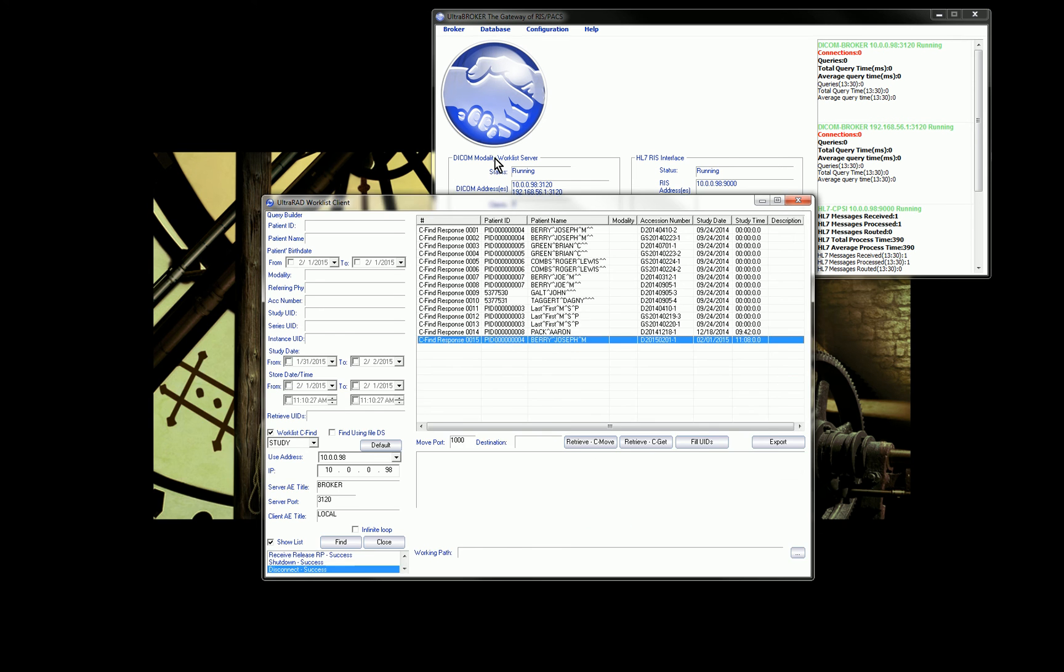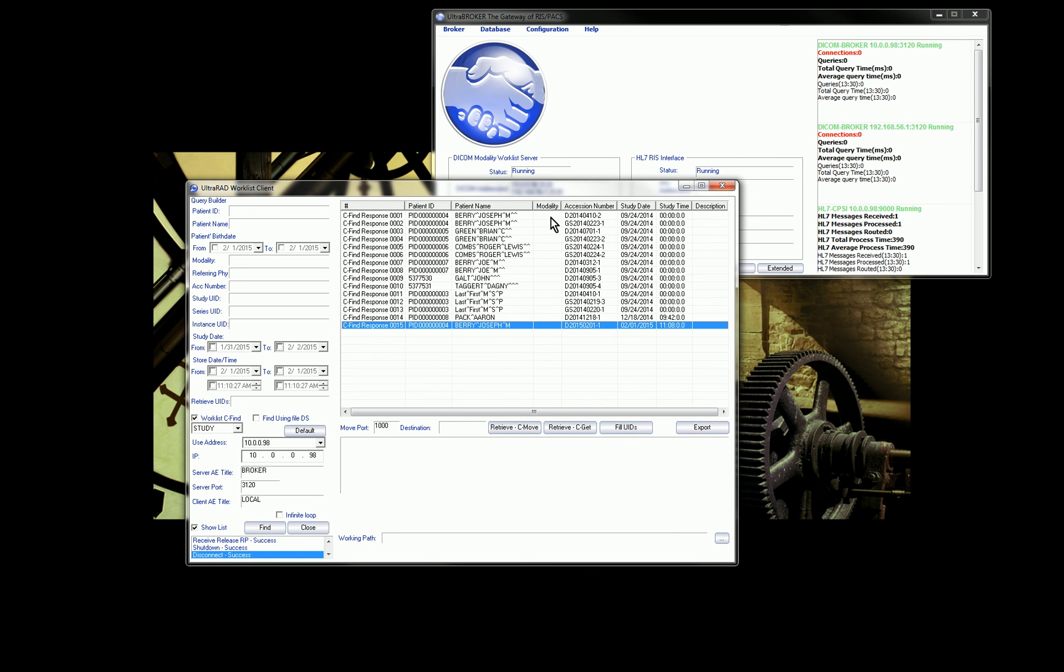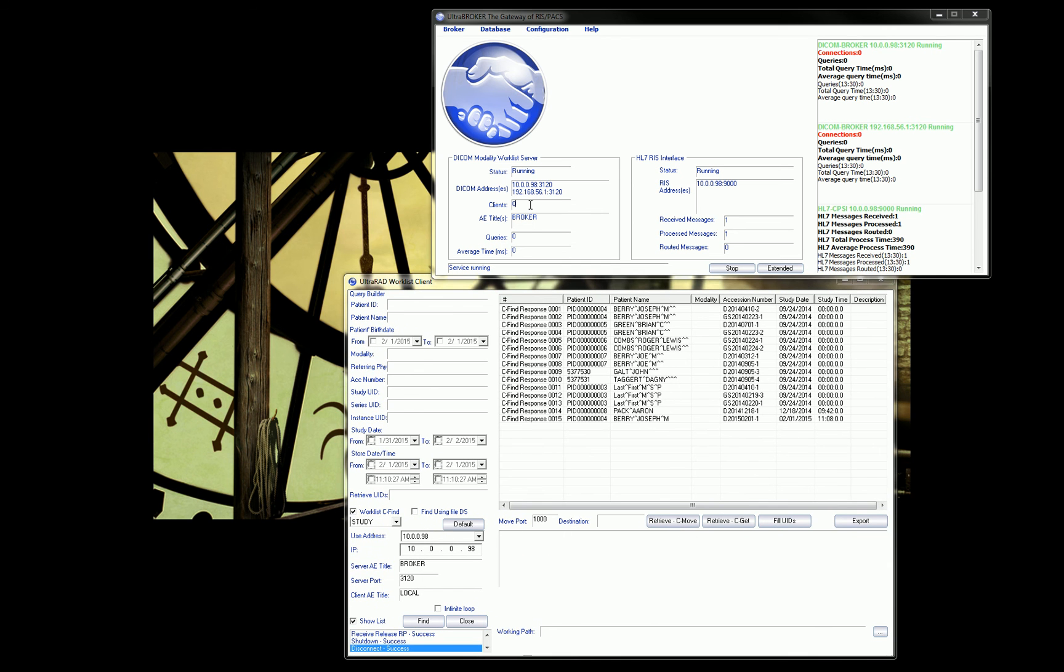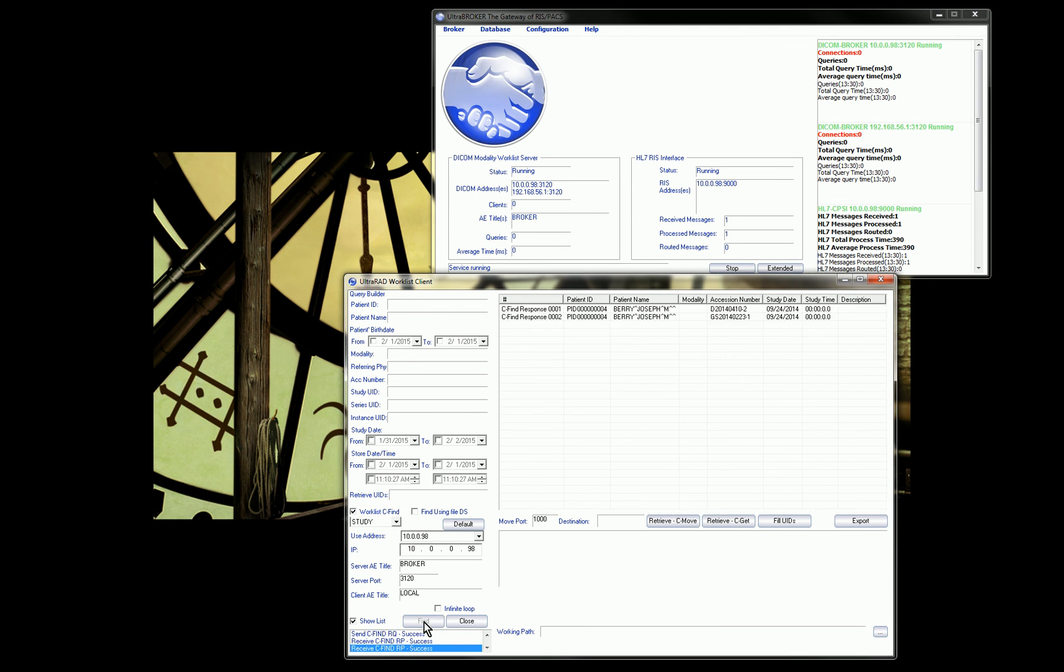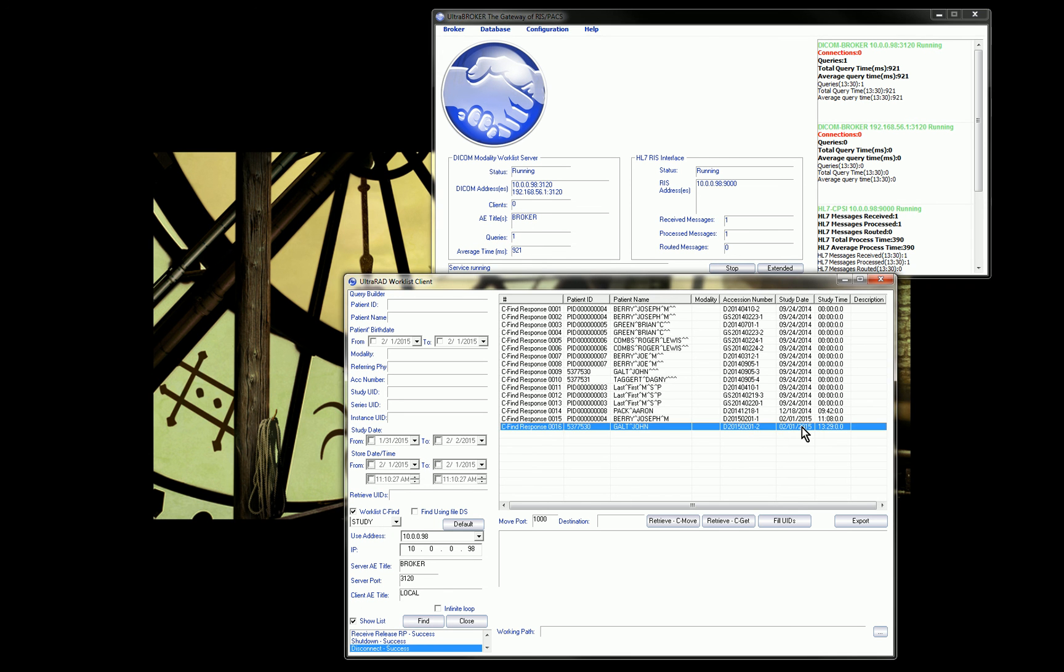Now that order is sitting in the broker waiting for a modality to get the information. I have down here a simulator for a modality. This is similar to how a modality would query. It uses Modality Worklist. You can see here, worklist C-FIND. It sends a query to the broker. You'll see here, I have zero queries that have come into my broker so far. I'm going to go down here and hit the find button. You can see here, I have a query that was run. If I look in my list, there's the order that I'm looking for, John Galt. You can see here at the bottom.